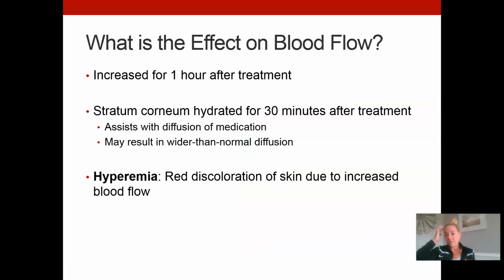Ionto will increase blood flow in the local area for about an hour after treatment. The outer layer of skin will stay hydrated for about 30 minutes, and that will allow medication to keep diffusing into the surface, which again may result in a little bit wider than normal diffusion of medication, but again, still more concentrated than taking a pill, less concentrated than giving an injection.